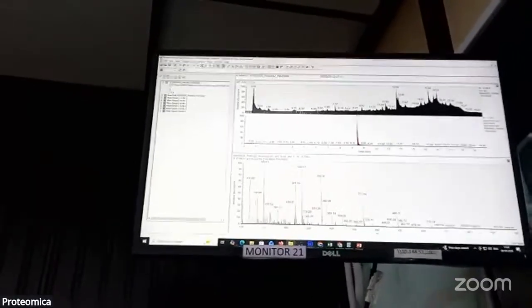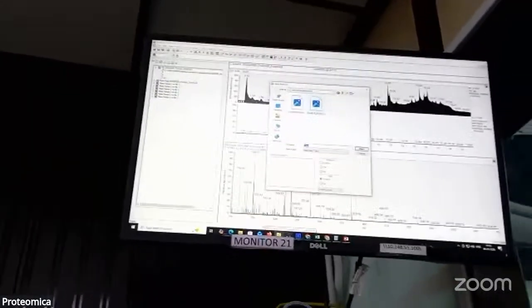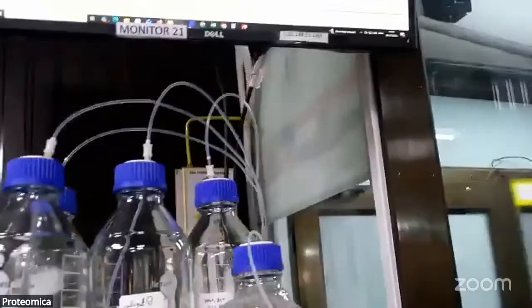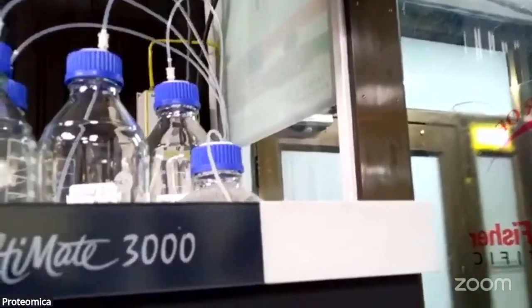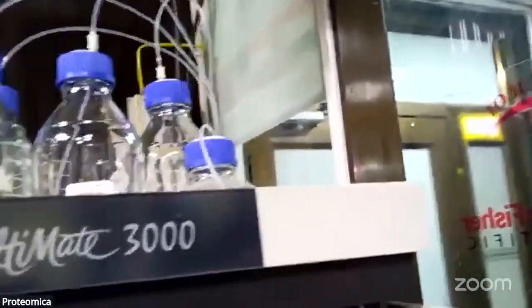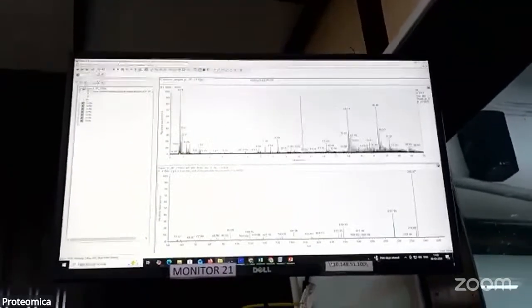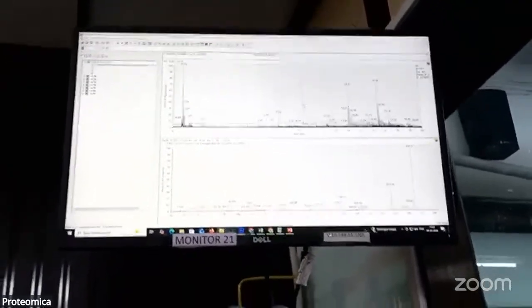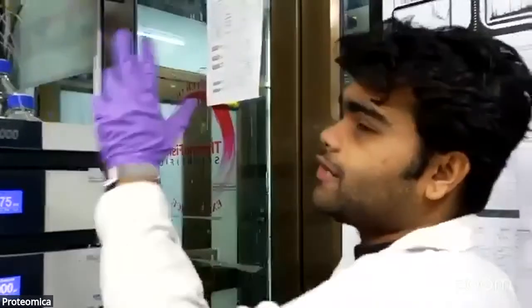Another important thing is that you can also go for targeted metabolomics. The difference is that from global metabolomics you get the entire bird's eye view of which metabolites are getting detected. Now suppose you have cohorts from different regions of India and you want to validate those metabolites in a different cohort. Global metabolomics gives you information about how the metabolites are getting detected, and you get the MS2 fragmentation, which gives information about the different fragments of the metabolites.